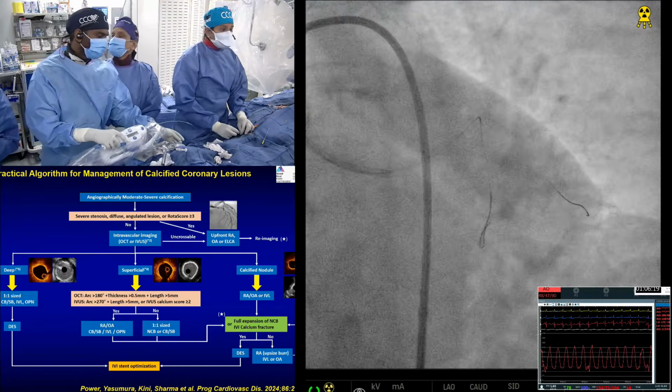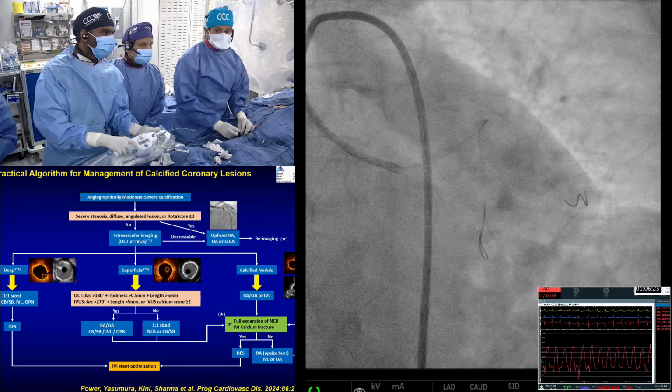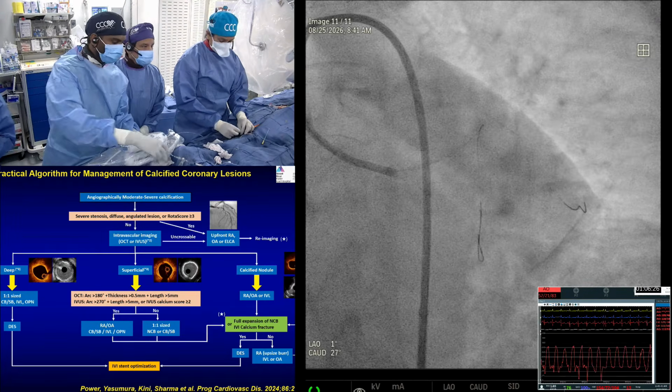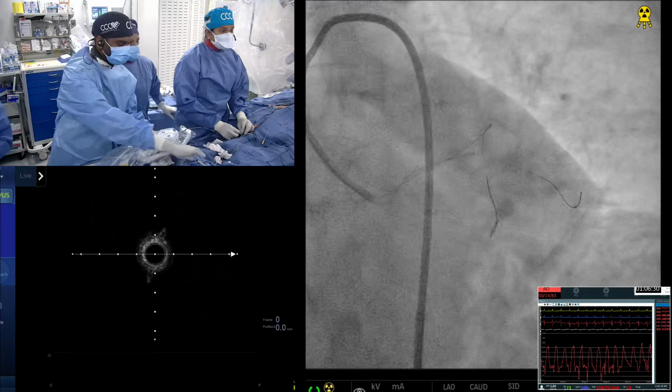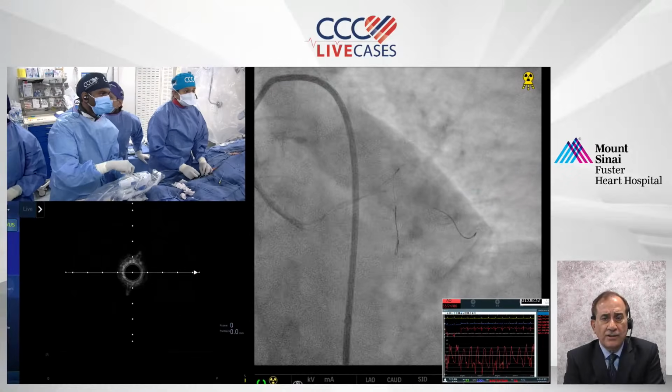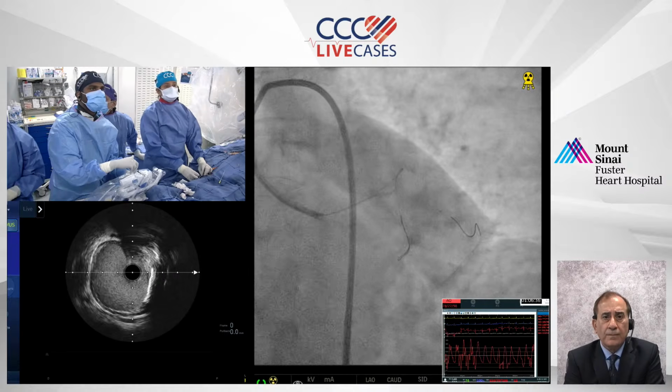Okay, let me do the imaging, then you quickly go there. The stent is ready. Only the ostium, okay? Right there. Check the image. Go ahead, Kiski. Start pullback. This is a proximal circ. It's coming.